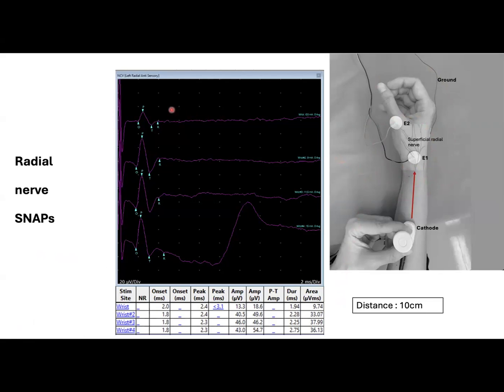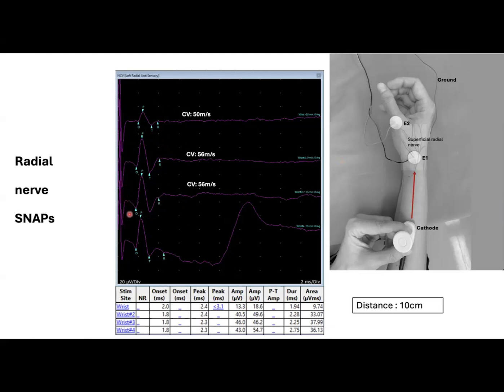The first tracing represents a radial SNAP with insufficient stimulation resulting in low amplitudes, around 13 microvolts. With supramaximal stimulation, the amplitude more than doubles, as you can see here in the middle tracings. However, if we go past the ideal threshold, we get this motor artifact. We should also remember that the amplitudes are usually higher with this type of electrode than with the ring electrodes that we frequently use.